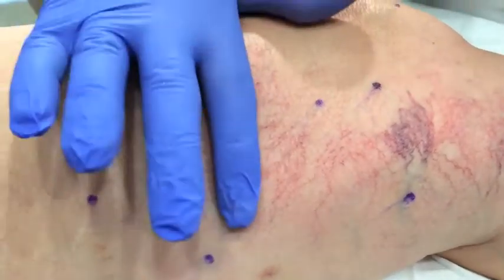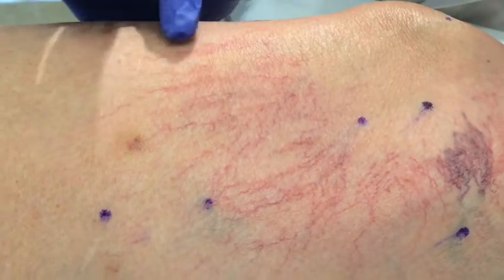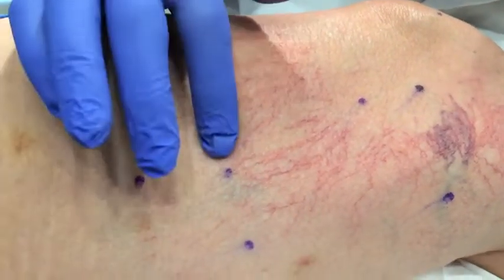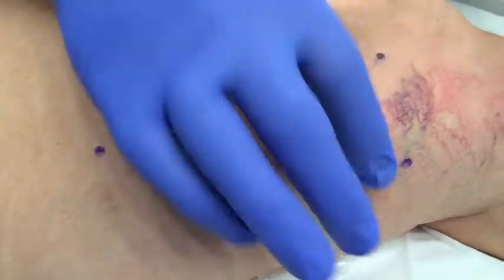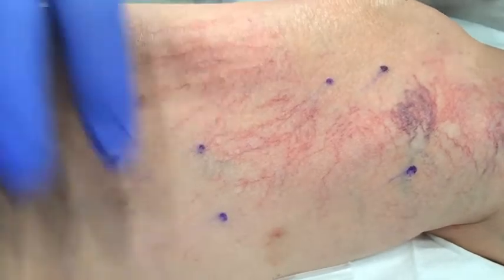We've lasered all these veins so far. You can see they're nice and red, a little bit raised. It's a very good response — an angionecrotic type of response. See the blue dots? These are where the reticular veins that are actually feeding into all this complex we're coming from.